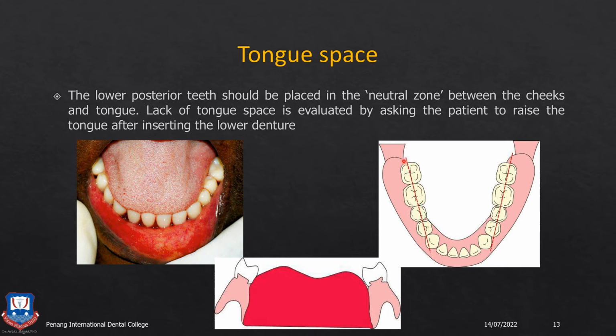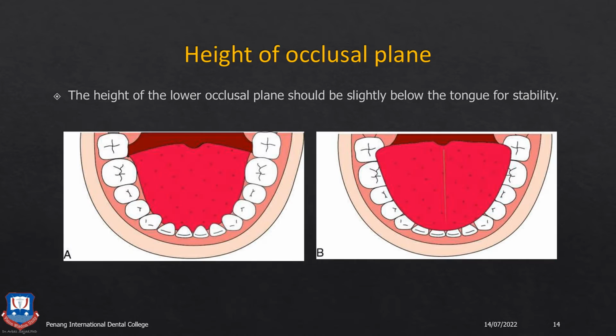So as I mentioned in the previous lecture, this is called the pound line. That is a line extending from the lingual border of the retromolar pad to the mesial line angle of the canine. So on this line, the denture teeth should not encroach, but they should be arranged on the crest of the ridge. If you need to do a crossbite teeth arrangement, you can do it for the posterior, but you cannot arrange the teeth in such a way that they encroach upon the pound line and finally encroach upon the tongue space, resulting in instability of the lower denture.